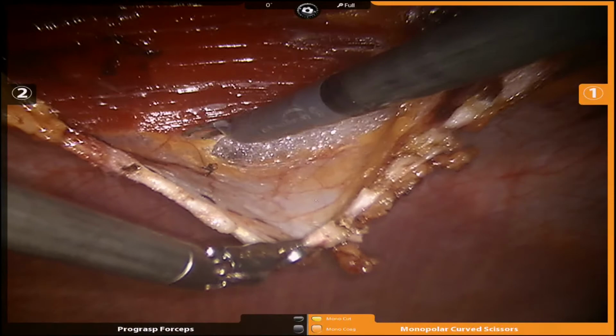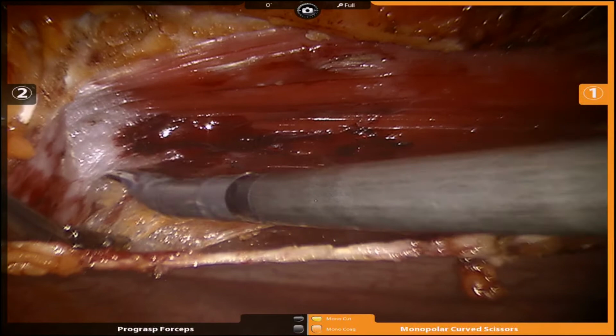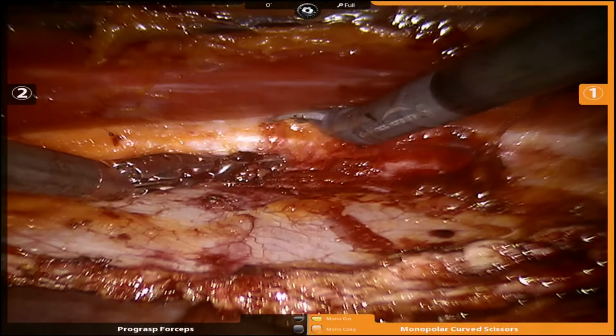The excellent optics of the Da Vinci robot, combined with the uniform retraction afforded to us by pneumoperitoneum, allows us to enter into an avascular plane, creating minimal blood loss. This is the edge of rectus.